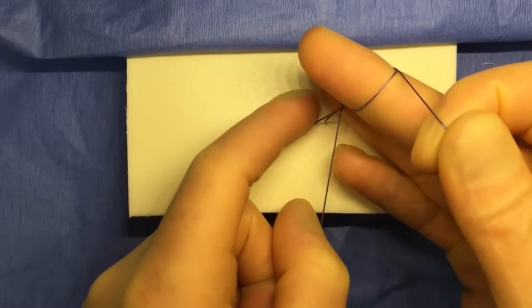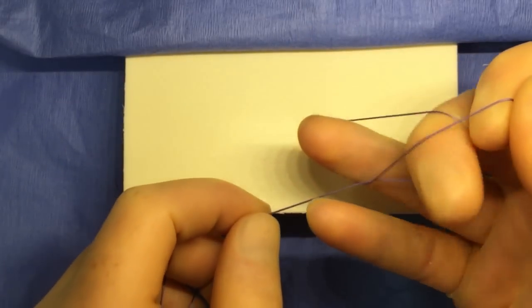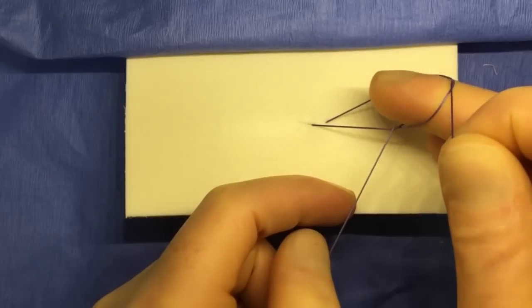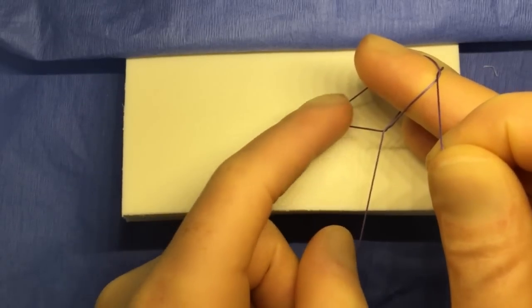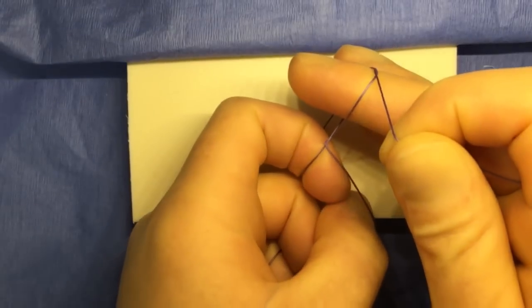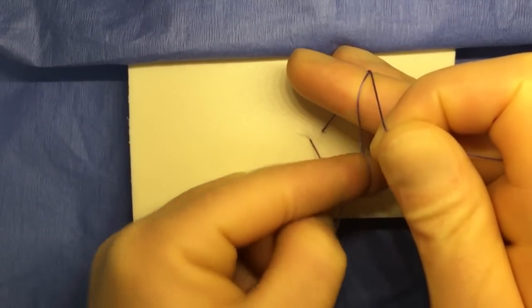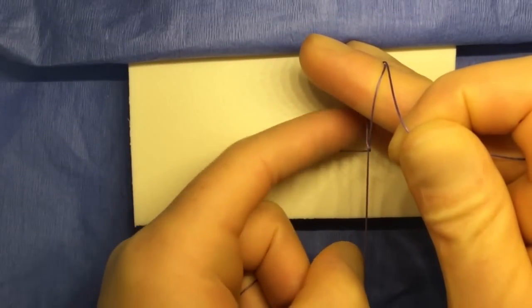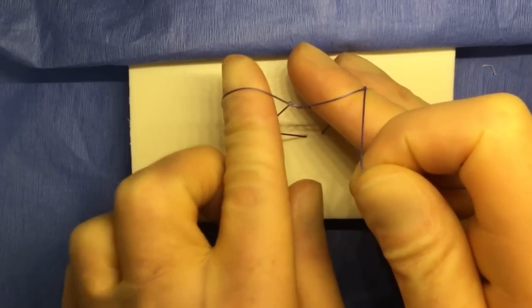Again, I'm doing that motion. This will create another triangle between my right ring finger and the skin. I'm going to use my index finger of the left hand to come across that string and bring the other part of the suture through that loop. That essentially will create the second throw that completes the surgeon's knot.